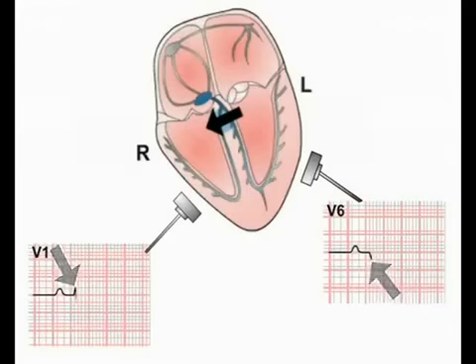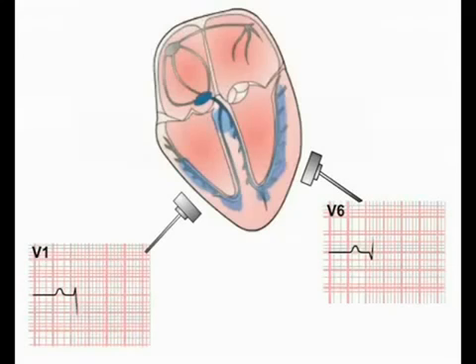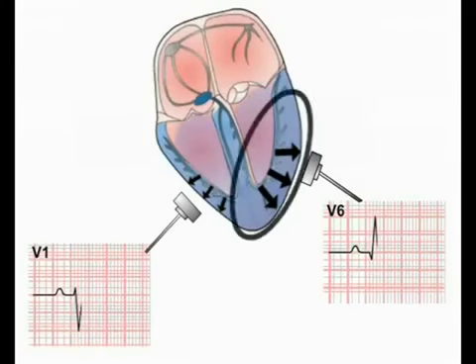As the septum continues to depolarize, the depolarization wave spreads out over the muscle mass of the ventricles. To understand what happens next in the recordings, it is important to realize that the magnitude of the electrical signal generated by depolarizing muscle is directly proportional to the mass of muscle generating it. What this means is that the more muscle present, the more electrical signal generated and the more signal the ECG machine detects. The left ventricle has a much greater muscle mass than the right, and so dominates the electrical signal of ventricular depolarization in all leads.